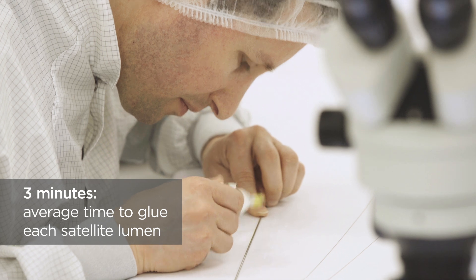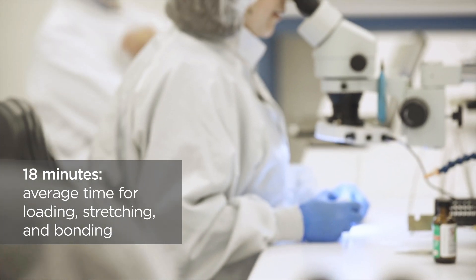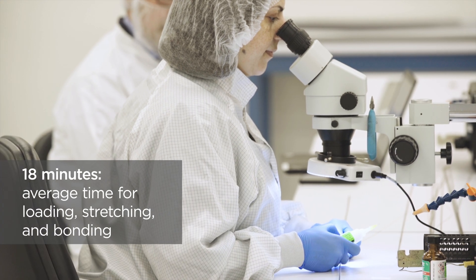However, the most time-consuming part of the process involves gluing each satellite lumen to the main liner. This took on average about three minutes for every satellite lumen, bringing the total average time to assemble the liners to 18 and a half minutes. In addition to the long build time, this process is often prone to error.